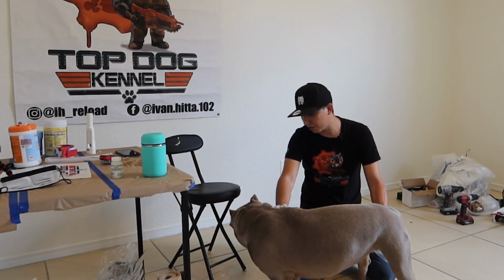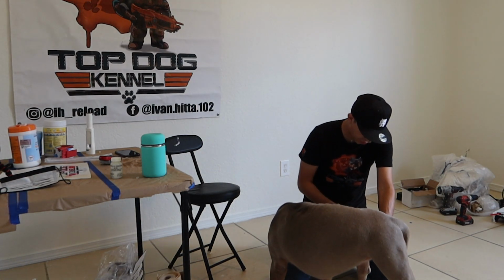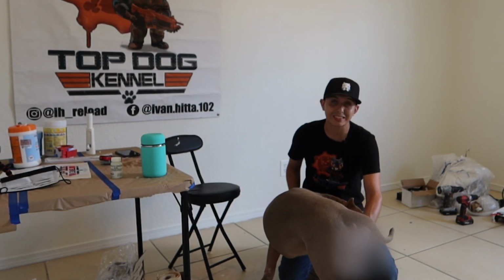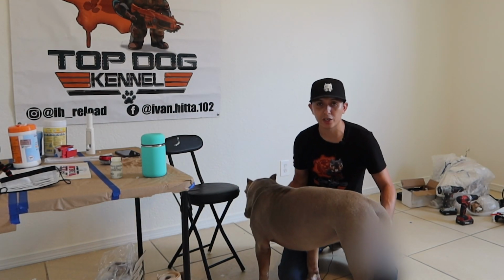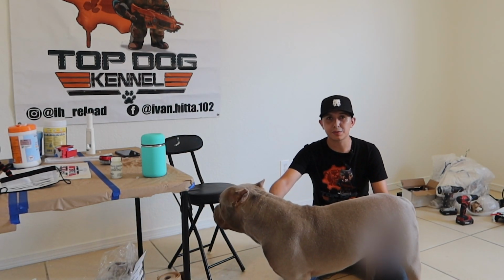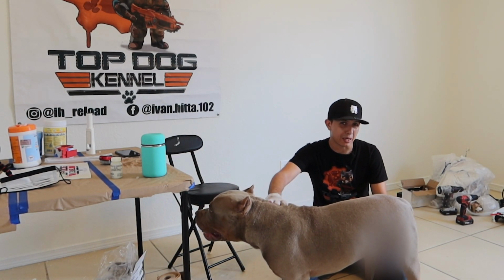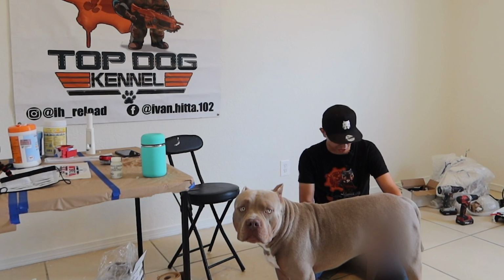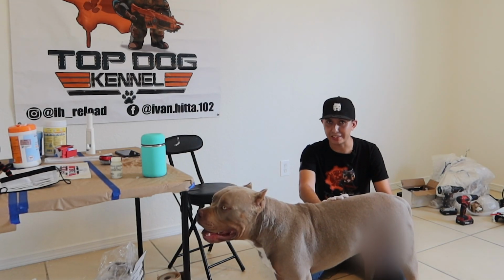So right here, we're pretty much just gonna wait till we're done collecting. We're gonna go through the clear fluid, which is gonna be the prostatic fluid. We don't want that fluid. We want the rich fraction of the sperm, which follows right after. That is the cloudy substance. The cloudy substance ends up coming about 5 seconds after, and it ends up being about a minute total that you'll be collecting that. After that, you can stop collecting. It's gonna return to clear liquid, and you could just stop there because after that, it's just prostatic fluid. It doesn't have any sperm.